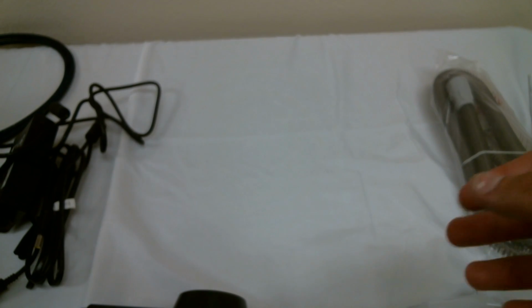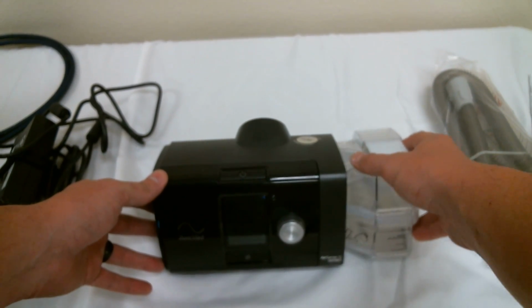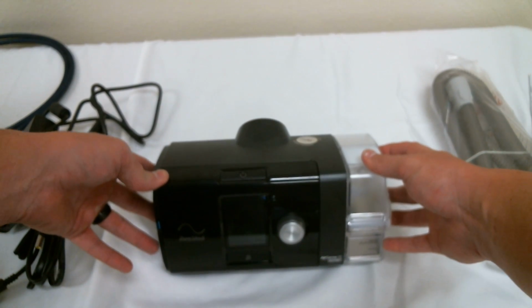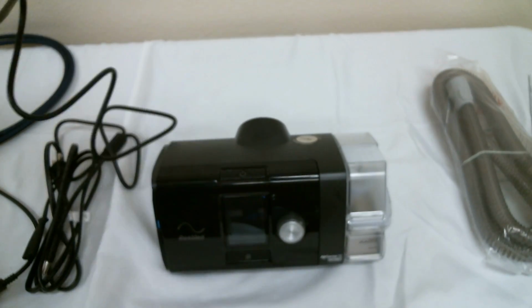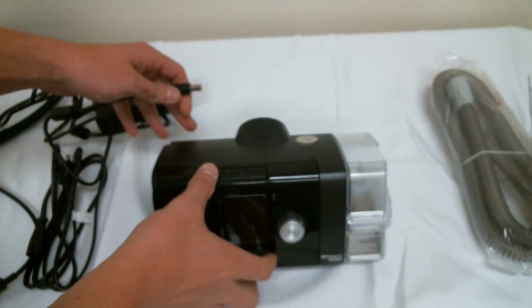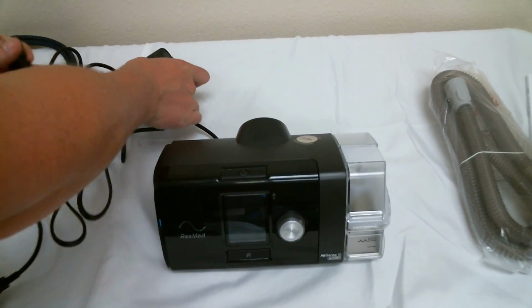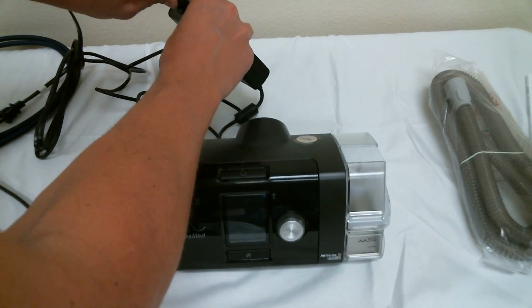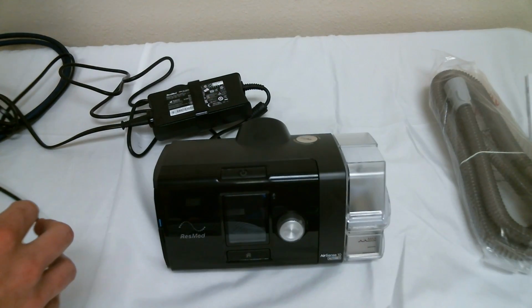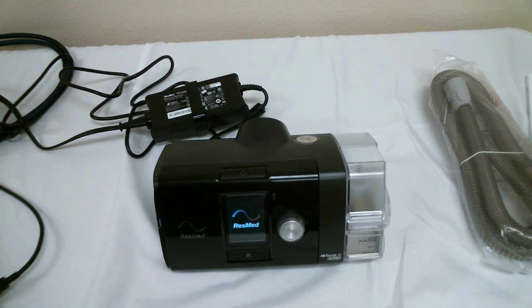Now let's go ahead and assemble your unit. First, we want to slide the humidifier chamber into the side of your device. It will not fit in any way other than the correct way. Next, we'll connect your power supply by inserting it into the back and then connecting your power brick to your AC power supply. Your screen should light up and may ask you to wait while it prepares the SD card.